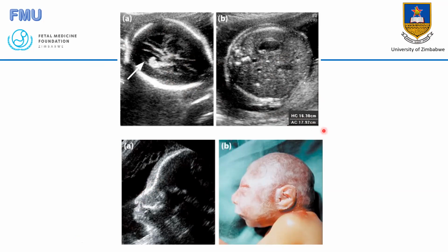Look at how it looks. Normally, they also have a small chin, and this is how the babies look at birth. The head is small, it's a tiny head, and a small brain, right? The prognosis is very poor with microcephaly. They normally have severe neurological and mental handicap. As a result, we offer them termination of pregnancy as an option, or expectant management, depending on the couple's preference.